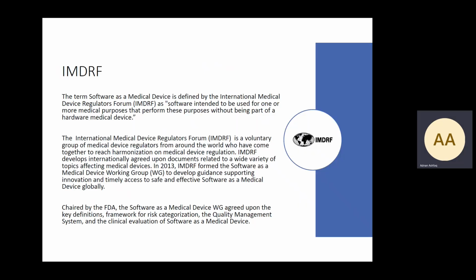So although 62304 remains the cornerstone of implementation for software as a medical device, it's also useful that there are industry guidelines or documents which the IMDRF, the International Medical Device Regulators Forum, which some of you might be familiar with, have formulated.